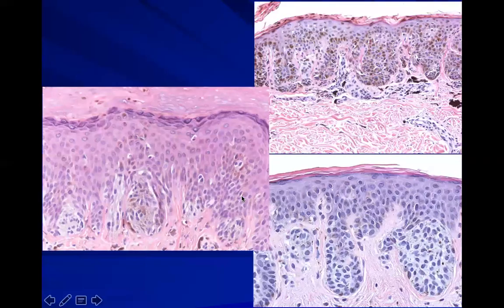So, as a side-by-side comparison, again, because I love those, round melanocytes make round nests, more lentiginous, causing bridging and tissue reaction with the lamellar fibroplasia, some pigment dropout. This is that architecture in the acquired nevi or in dysplastic nevi. Spindled, more elongated nests, allowing for a few cells above. This is your Spitz nevus.